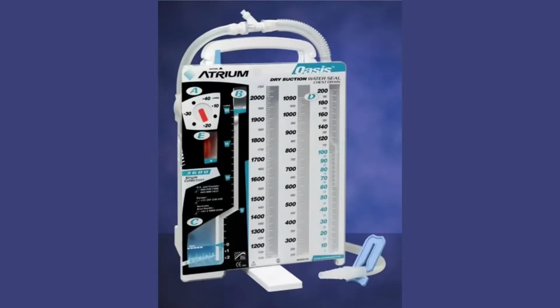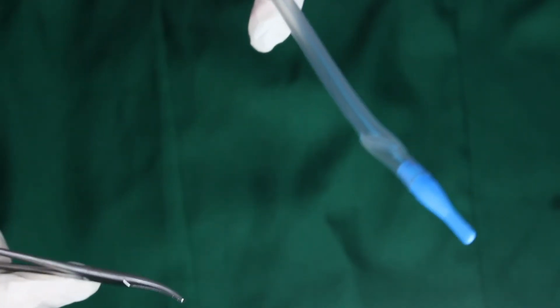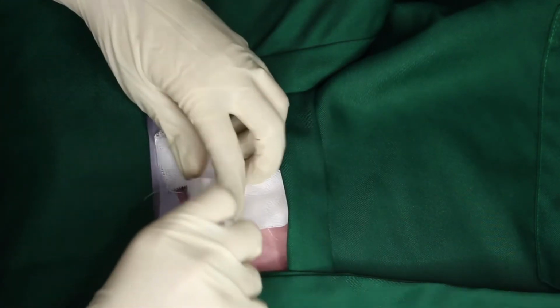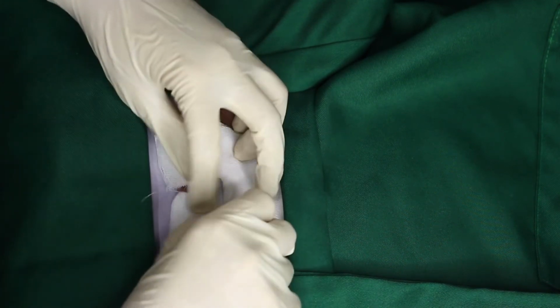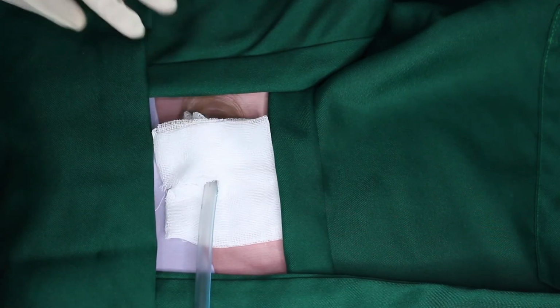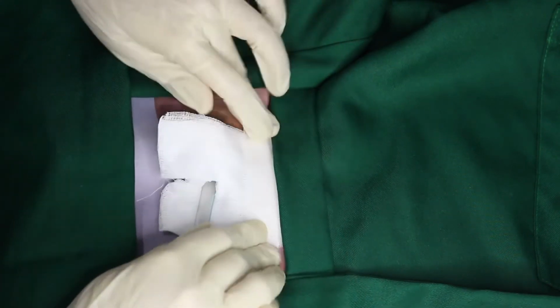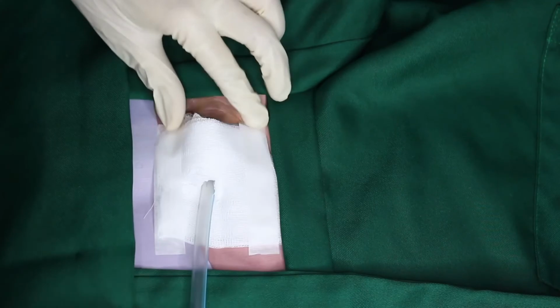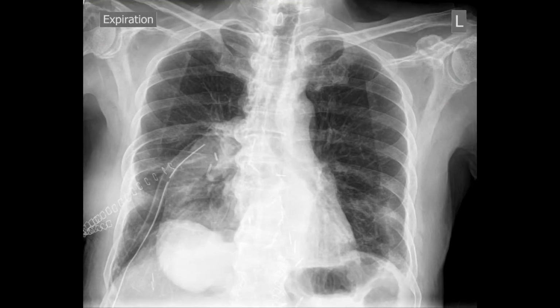Connect the tube to the underwater sealed chest drainage system and remove the distal Kelly clamp. Place a vaselinized gauze around the entrance site and a sterile dressing on top. And obtain a post-tube insertion chest X-ray to check the position of the tube.